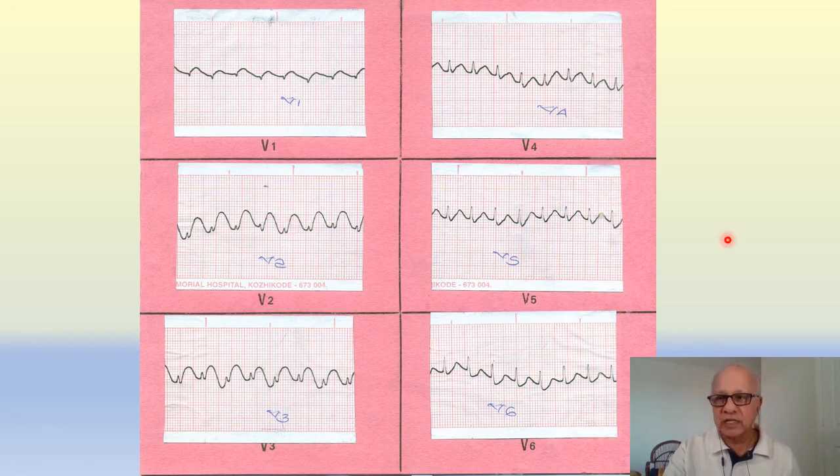Now, my next question here was, what could have been the clinical presentation of this patient, isn't it? The sinus tachycardia would give the clue to this clinical presentation. A patient with a hyperacute anterior wall myocardial infarction coming with sinus tachycardia. Possibly he could have been in hypotension. The blood pressure could have been low. He could have been even in cardiogenic shock, or he could have been in acute pulmonary edema. These are the three things.